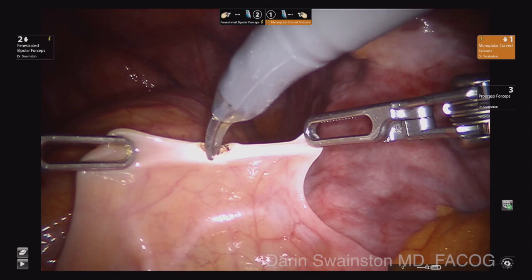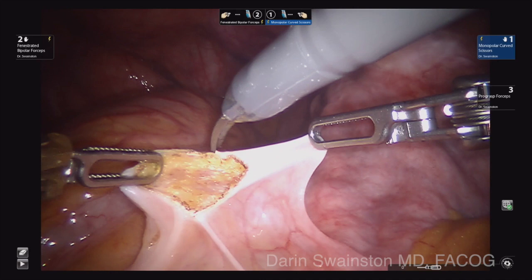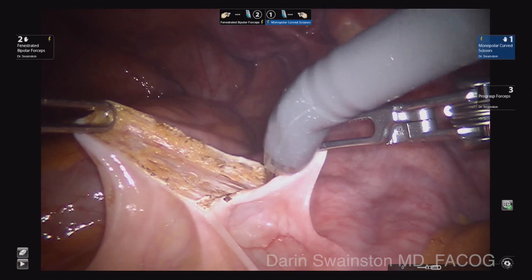Both instruments are used to pick up on the peritoneum to stretch it out. I did not speed up this portion of the procedure. I want to show how careful and methodical you need to be over the sacrum. Some people will do this procedure first just in case they are unable to dissect the area over the sacrum that is necessary.